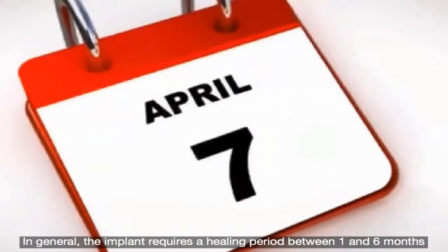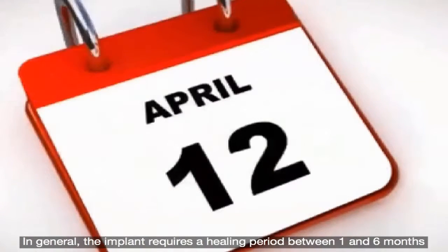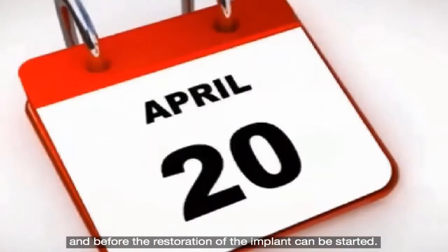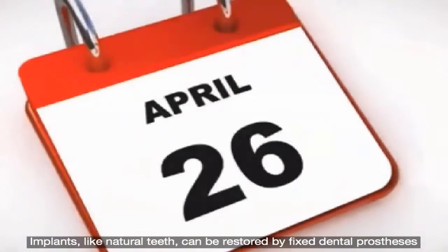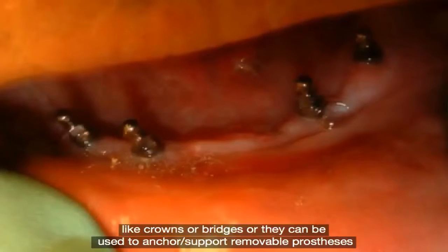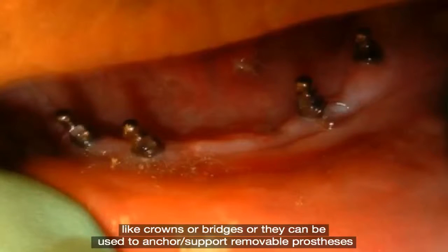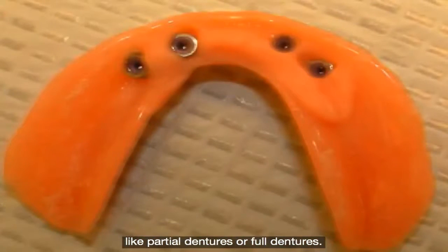The healing period after implant placement can vary significantly. In general, the implant requires a healing period between one and six months to become well integrated into the bone before restoration can begin. Implants, like natural teeth, can be restored by fixed dental prosthesis such as crowns or bridges, or they can be used to anchor or support removable prosthesis like partial dentures or full dentures.